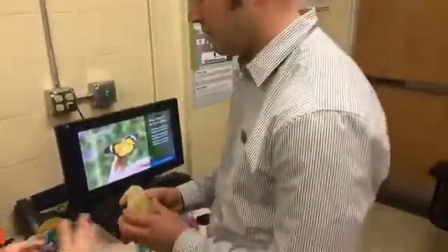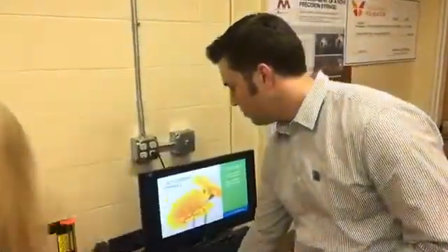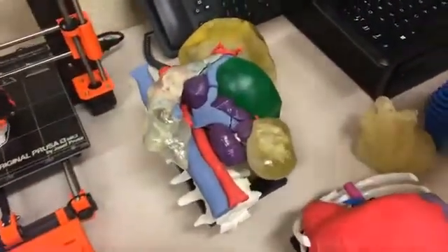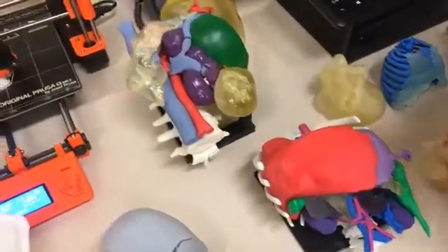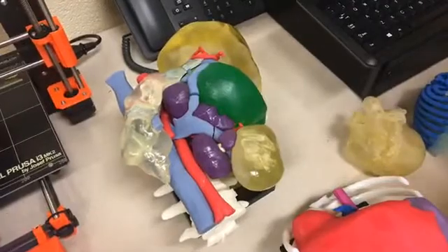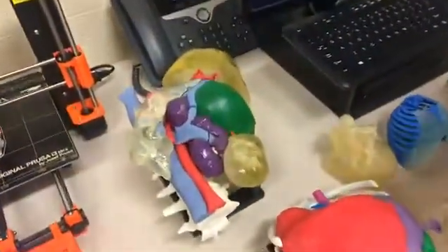And then how did it evolve from cardiology? I see a couple more hearts there. And then what are these multicolored ones in the middle? So from cardiology, once we figured out that it was working really well for our cardiothoracic surgeons, we opened it up to basically any other specialties that thought that they could benefit from it. One of our first physicians that reached out was Dr. Shahab Desalam, a general surgeon that resects tumors in patients. These two are models that he used to map his surgeries before he went in.